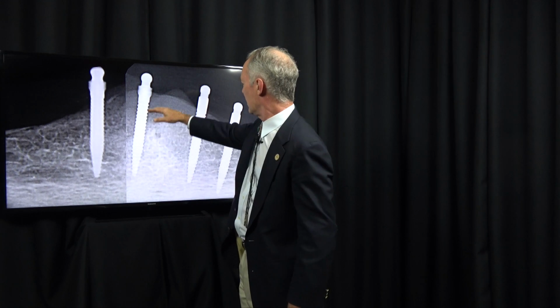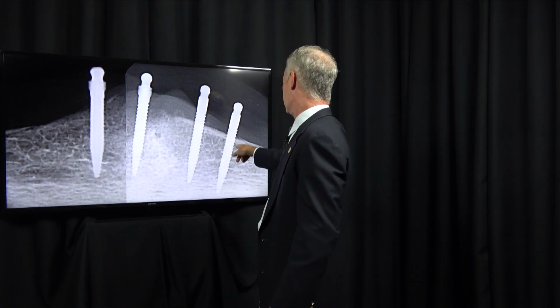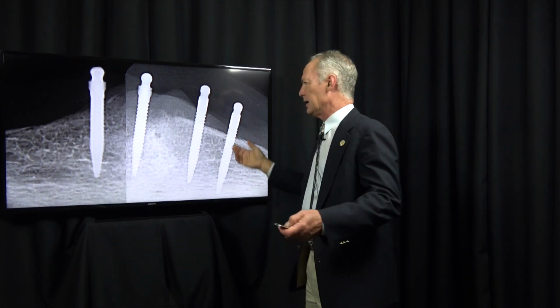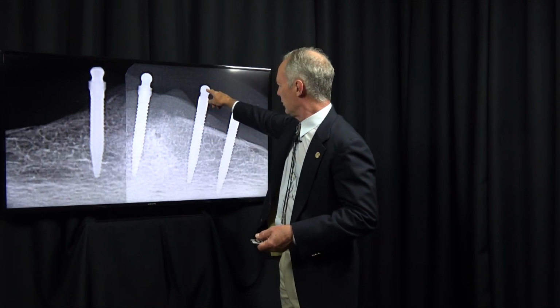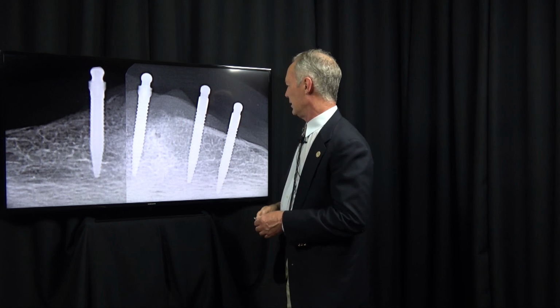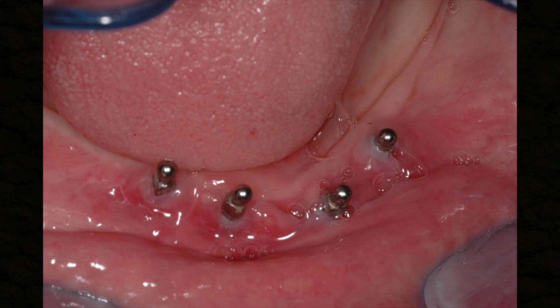You would like all the threads to be in the bone, if possible. Sometimes that doesn't happen, and that's okay, because you can't keep screwing them in to try to get all these threads in the bone. At that point, you wouldn't have any of the implant sticking up for the housings. So here we have healing 2 weeks post-op.